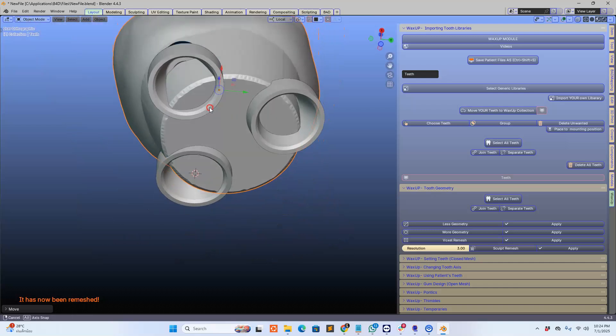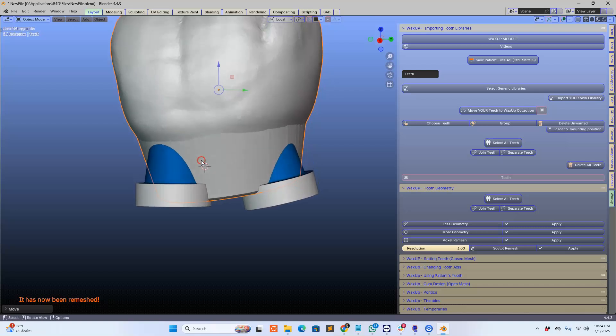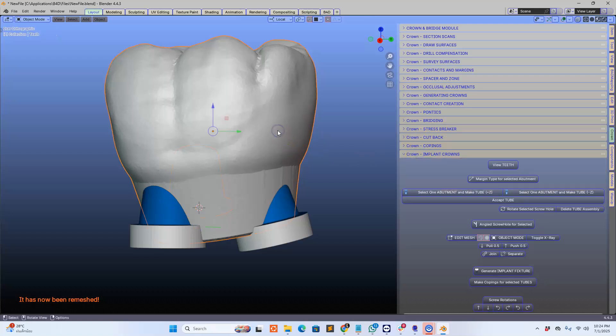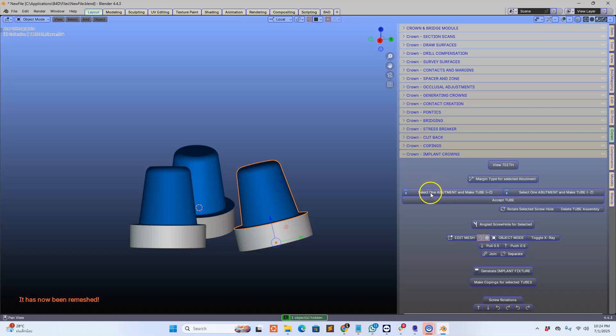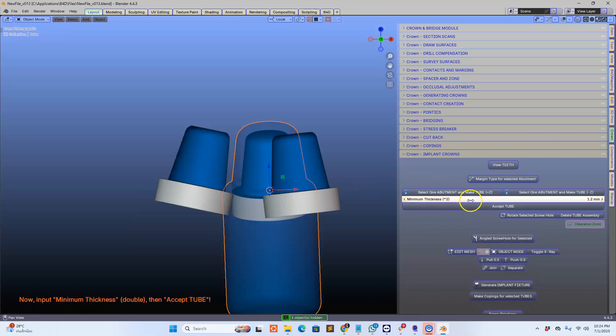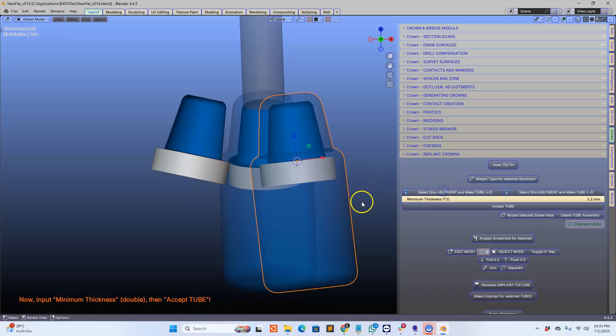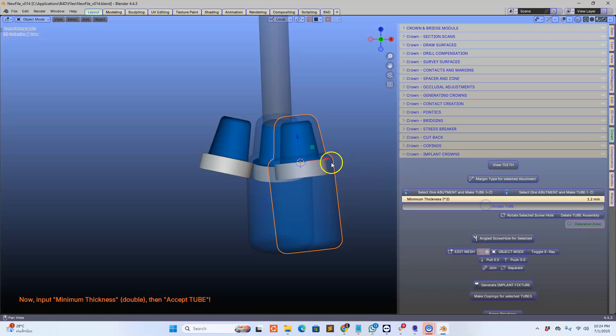Now we've got three implants which are very very close together and I'm going to have some fun here — I hope you guys are watching and you're going to enjoy this as well. I'm really excited about Blender 4.4, it is unbelievable, it's working much faster. So here — the crown module — go to the implants, I'm going to hide this away, and then we're going to make these assemblies. It looks a bit like a bottle with a screw hole cutter at the top of it.